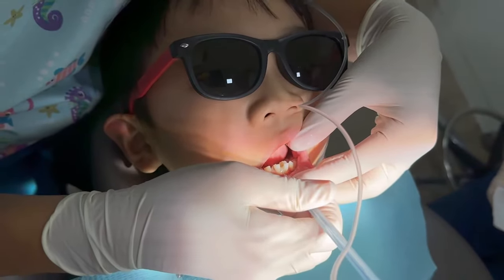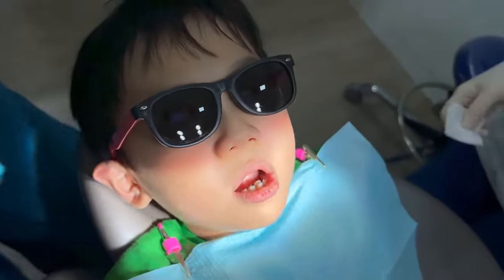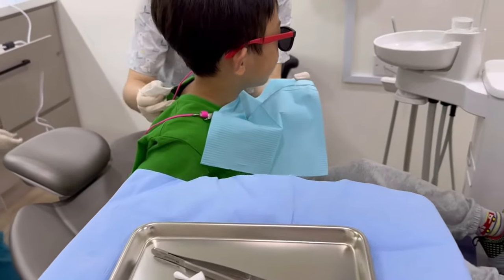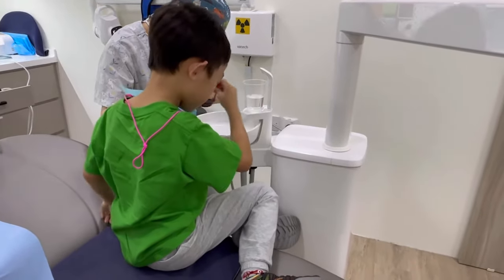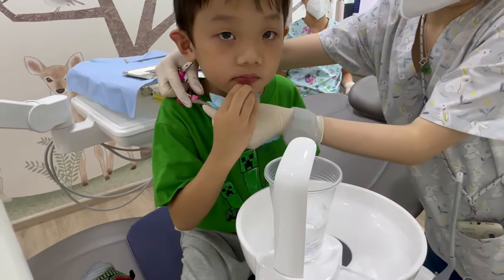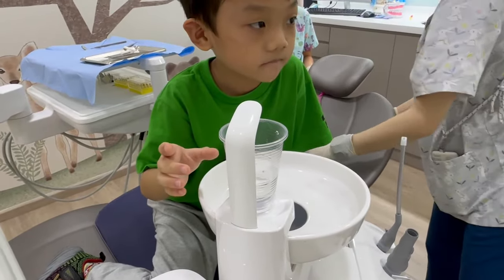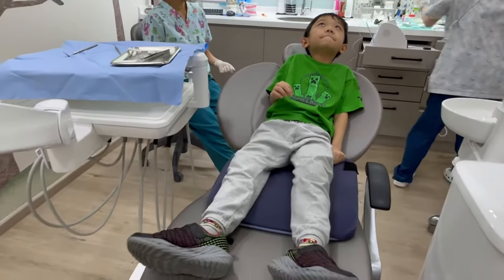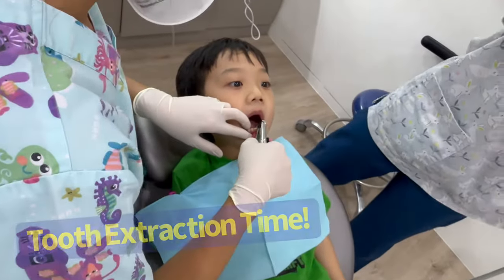We count to 10, okay? 1, 2, 3, 4, 5, 6, 7, 8, 9, and 10. Raise your mouth. Good job. It's very bitter, right? Does your lip feel numb? You don't feel anything yet? So don't touch it, okay? Let's gargle. Good boy. Now you're done. Does it feel funny? So now we see whether it's really shaky or not — that's why we're shaky shaky.